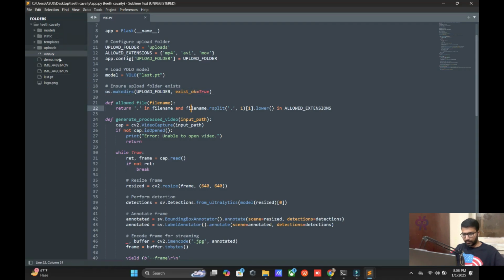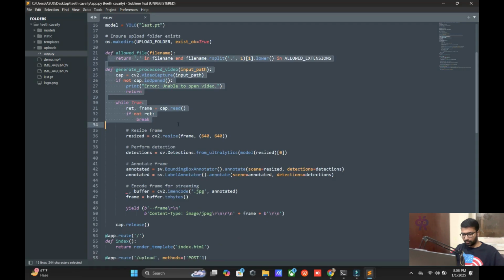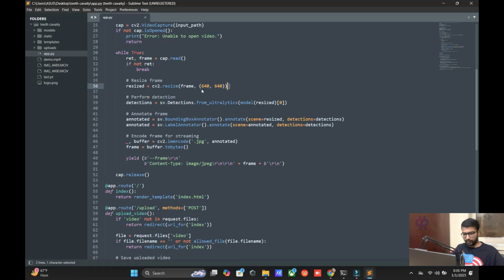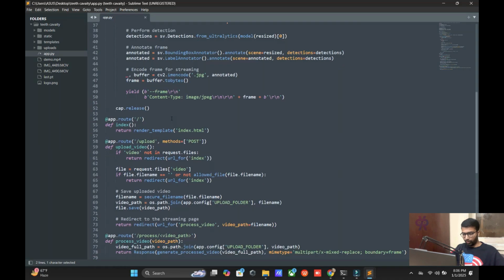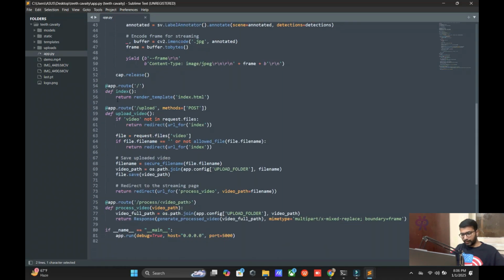Yes, this one. And after that, you can see that we define the function for video processing. Here we resize to 640, the video format, perform detection and annotation, encode the streaming as JPG, and export the output in video format. After releasing, you attach the HTML index, meaning the front view. Okay, after that you can see we save the video and redirect to the stream page. Okay, after that you can see we close the project and here get the IP.